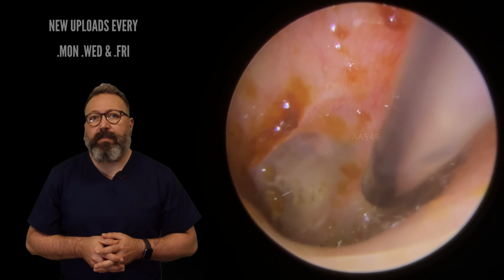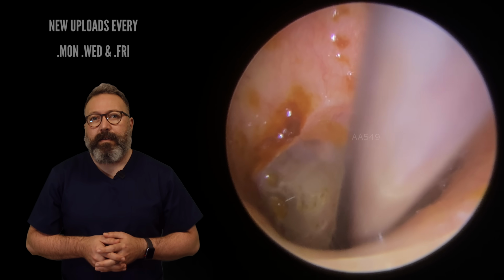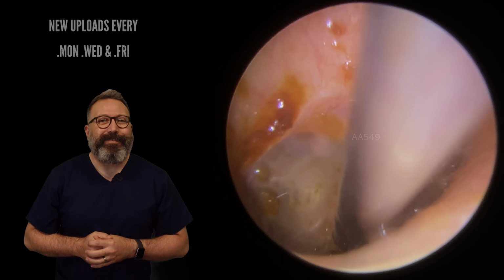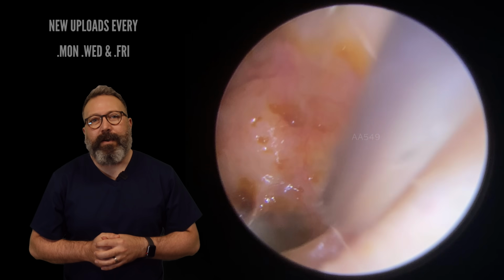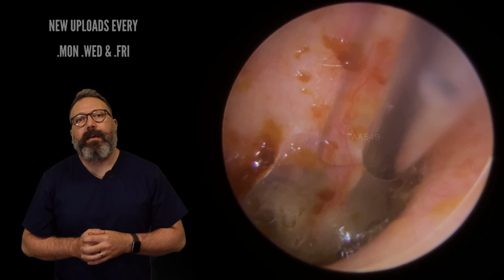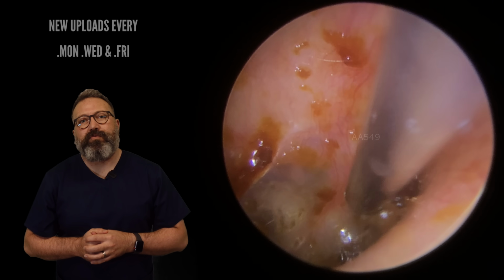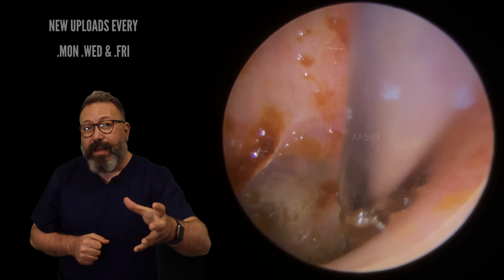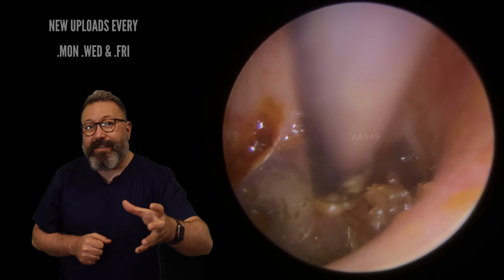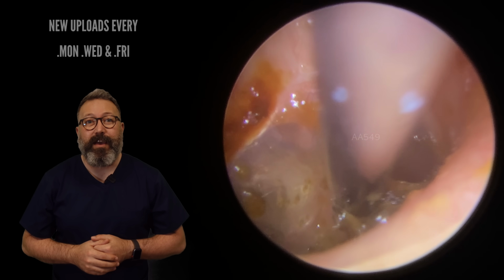So let's work our way back along. How much is down in here? I know, I've seen it before, but there is a lot down in there. Oh, we've gone very dark. There we go. So we're back in again now. Aiming for that top corner there. Draw it. Oh, there we go. Did you see that start to draw across there? Keep an eye on this now, guys. Look at that skin layer coming away. It's deceptive how much is down in that area there.